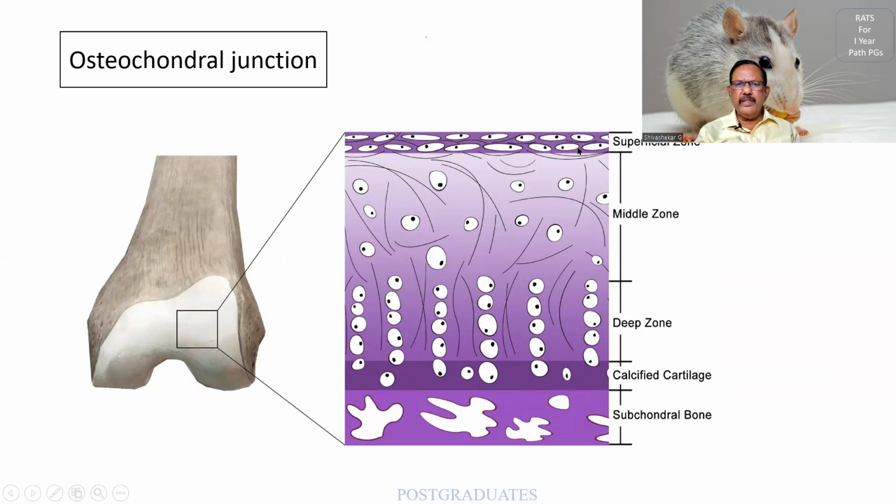This cartilage itself is divided into superficial, middle, and deep. Superficial means it is not so very mature, but later on you find it becomes perfectly mature. They are also very orderly in arrangement, and there is a matrix that is separating it. And this is the costochondral junction, below which there is a subchondral bone. More than costochondral, I should have called it osteochondral junction.